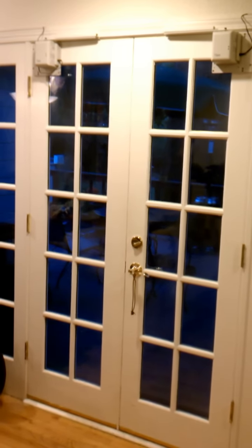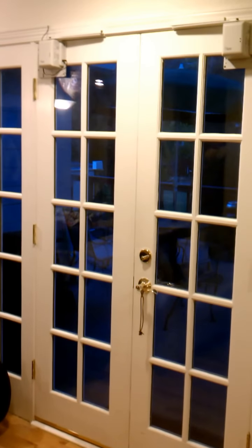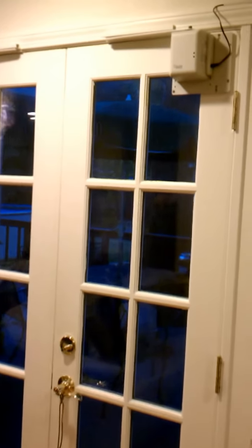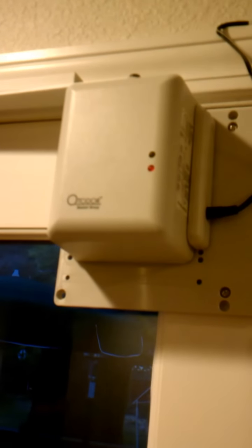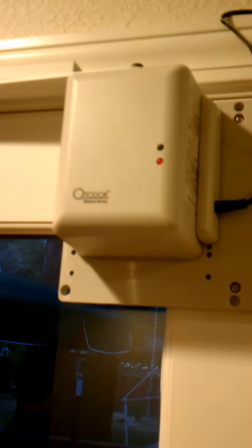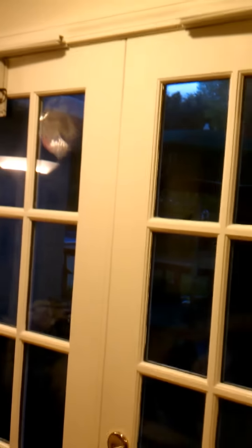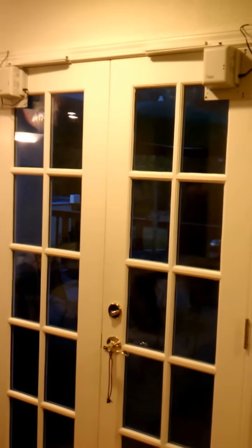For a patient with disabilities who is unable to open doors, a remote door opener is an option. This is the SkyLink AutoDoor DM150 automatic door opener. Two units were purchased to install on each side of a pair of French doors. No other modifications to the doors were required.